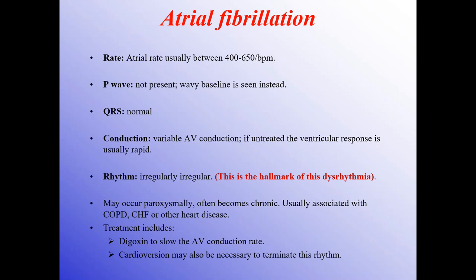So you are not able to appreciate the QRS complex. Means you will be able to appreciate the QRS complex, but you can't appreciate the P wave. But the irregularity in the rhythm will be a basic sign that there is AF present.